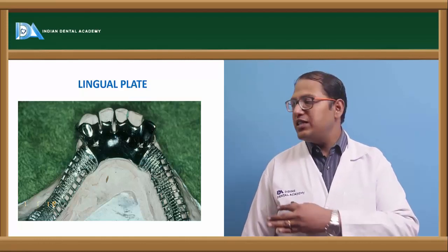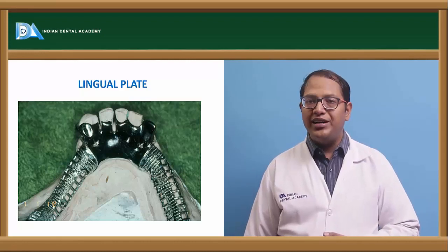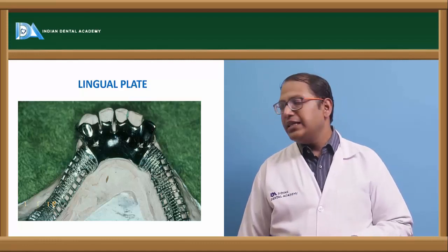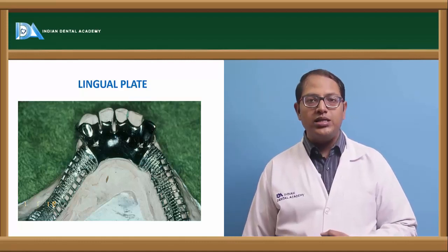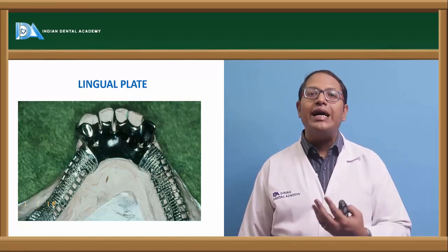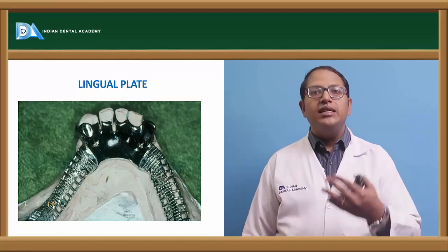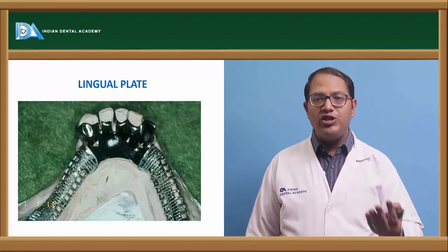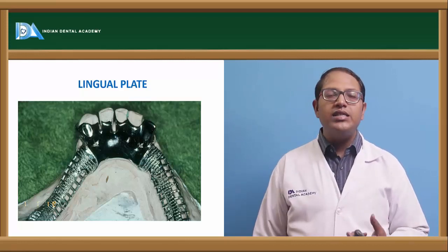Now the lingual plate is basically covering the tooth. Decalcification is the biggest question here. Yes, that is an added disadvantage with this kind of major connector. Another thing with the lingual plate is that it can be used in class 1 or class 2 edentulous situations. But one problem is that it does not give any space for oral hygiene maintenance. Also, it can interfere with the tongue at times. It is only indicated in those cases where the sulcus depth is less, so it is half pear shaped in structure. So it is into less oral hygiene maintenance.